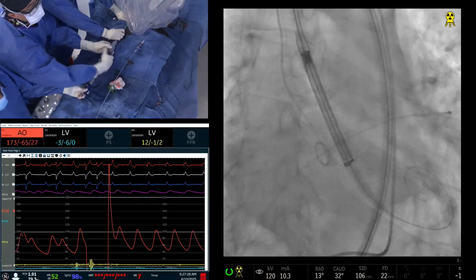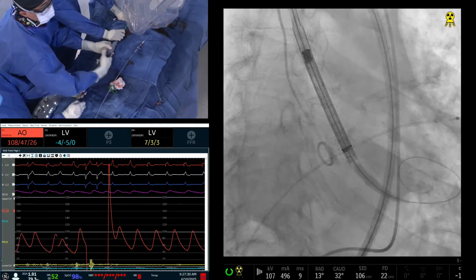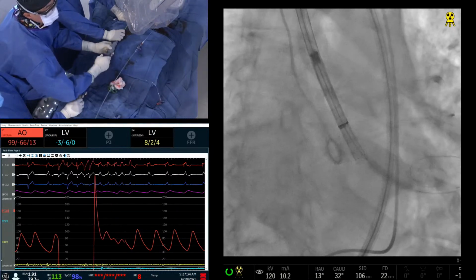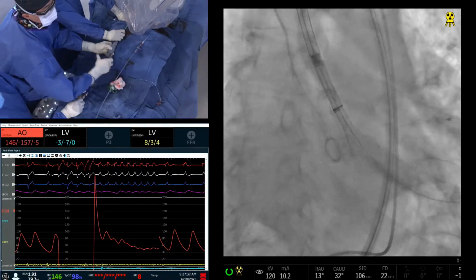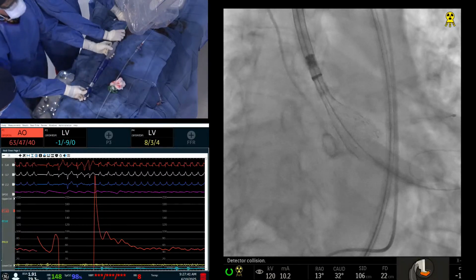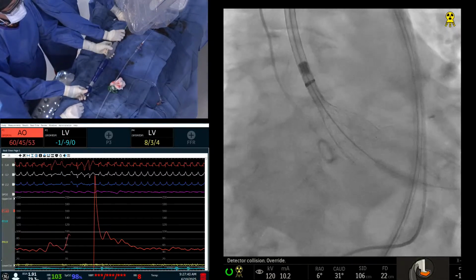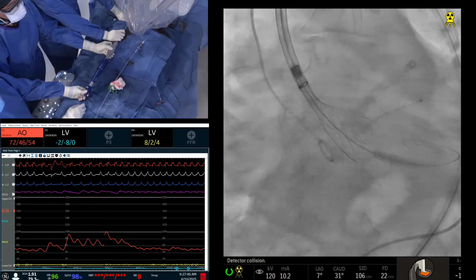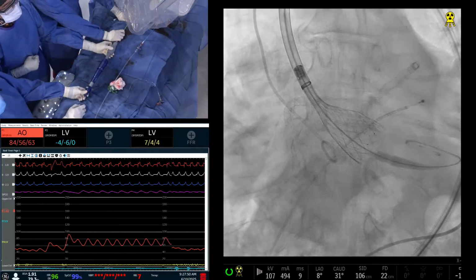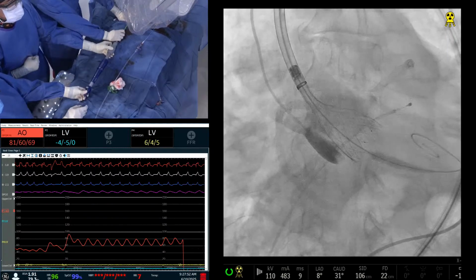Okay, 150. Inject. You think your C-tab is good? No, I'm okay. Good. Okay, 100, please. Yep. Okay, let's see, maybe a little deeper. Let's take a look. Inject. Actually, I don't think you're bad.